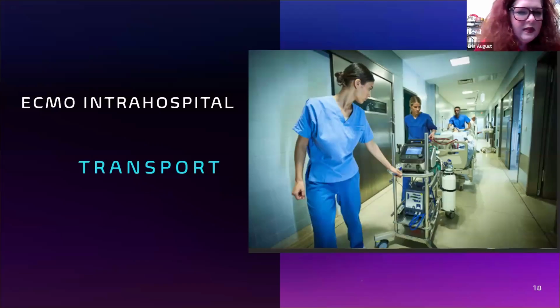Intra-hospital transport, again, doing the same thing. We talked about all these other scenarios. I highly recommend this. It is not done often enough, but it should be something that should be considered more often. And you really should perfect this technique through simulation and wet lab prior to doing out of house transports, right? We have to perfect in-house first. We have to have our house in order before we go outside. So the more practice you have, as I said before, the more you build the confidence of your team, the more your team is on board when it's time to go from in-house to out of house. Because why? They feel confident, they feel safe, and they've practiced enough that it becomes muscle memory.